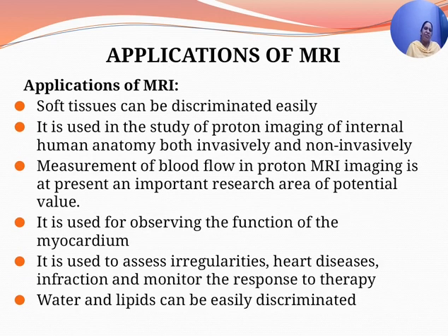Then the applications of MRI. Soft tissues can be discriminated easily. It is used in the study of proton imaging of internal human anatomy, both invasively and non-invasively.